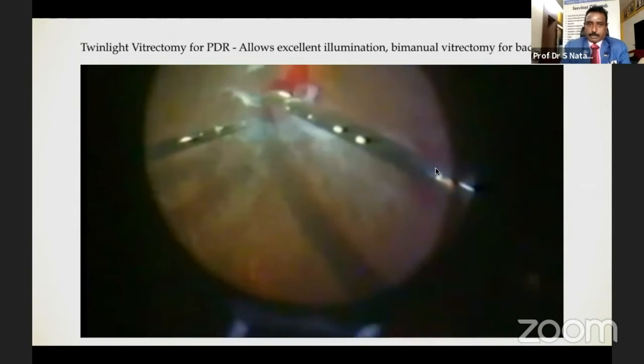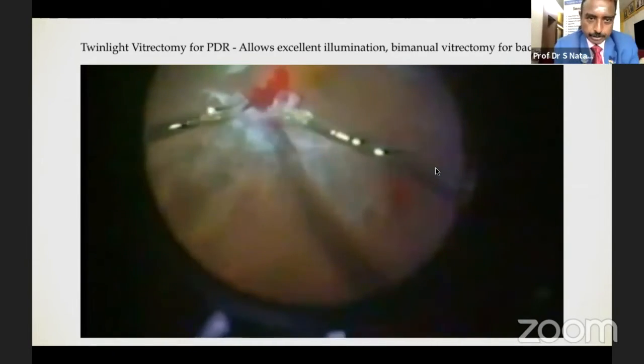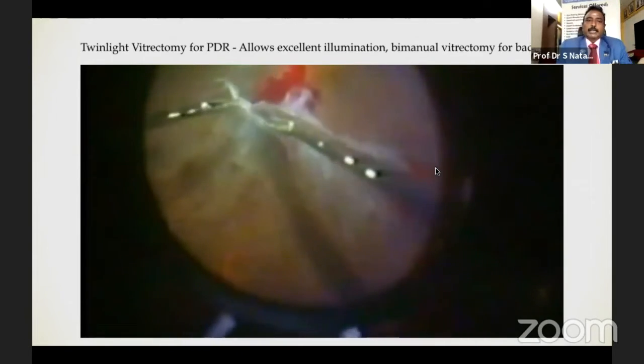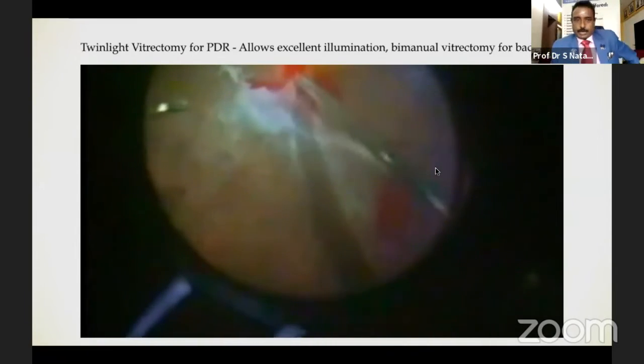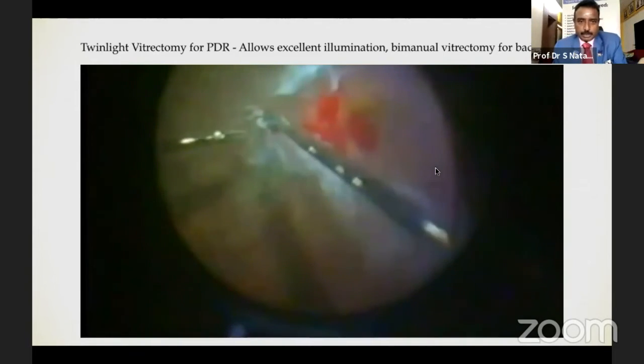It needs meticulous dissection and patient surgery, and a persistent and precise surgery is required. So I'm segmenting and then delaminating and then finally removing the tissue bit by bit, but maybe en masse. And then you can remove the tissue for studying also using electron microscopy for histopathology.